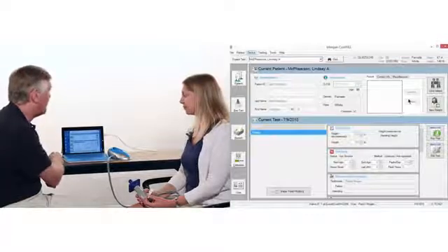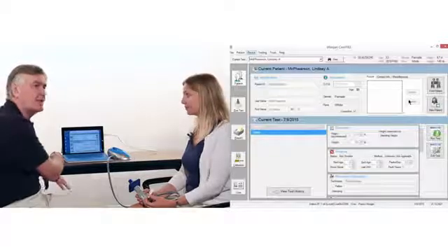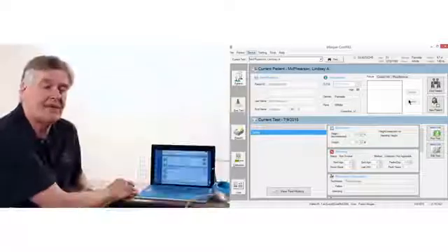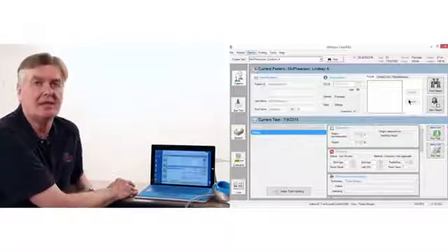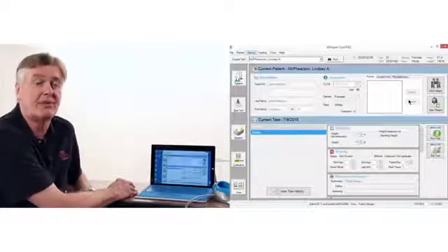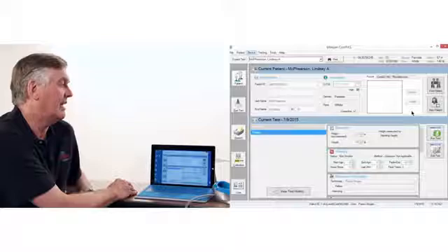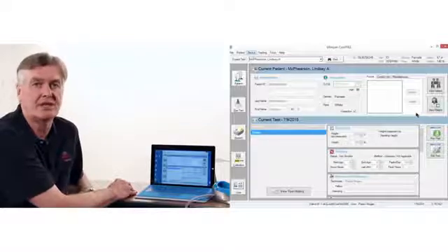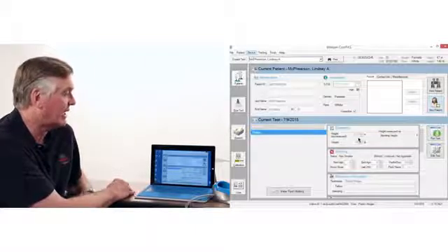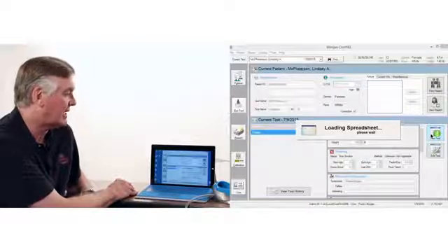The test subject is remembered in the database. If it's a new patient, then you would enter obviously all of their foundation information, date of birth, and so on. If it's something that's connected to an EMR, we can directly, through orders, recall the patient information from the EMR. In this case, we're simply using a standalone computer, so there's no connection to another database. Having entered the patient information, I can confirm the height and weight and go into running a test.